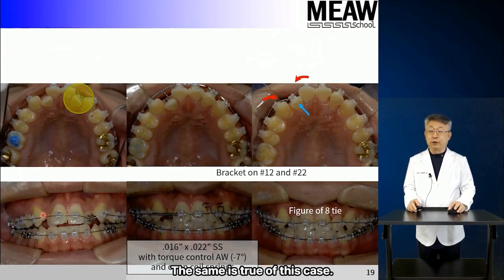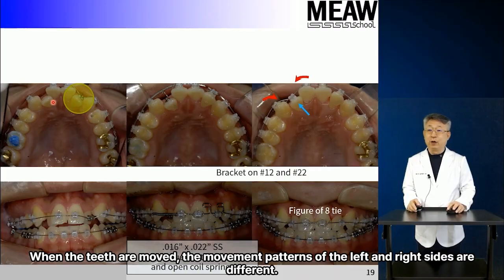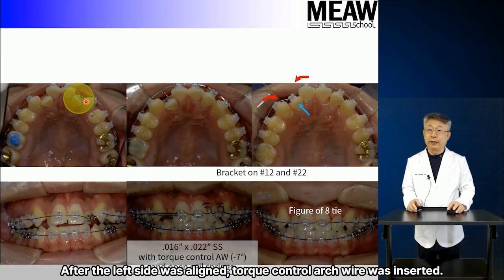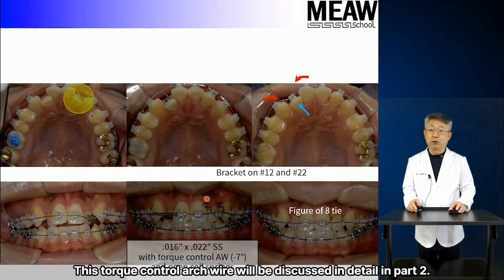The same is true of this case. When the teeth are moved, the movement patterns of the left and right sides are different. In this patient, the left side moved faster than the right side, so the left side was aligned first. After the left side was aligned, torque control arch wire was inserted. This torque control arch wire will be discussed in detail in Part 2.